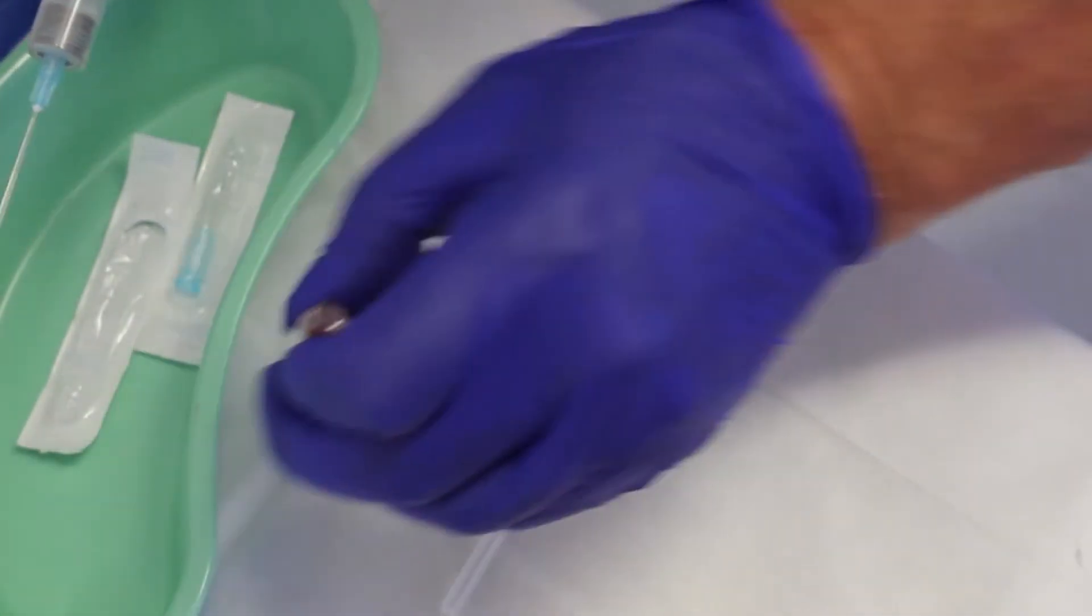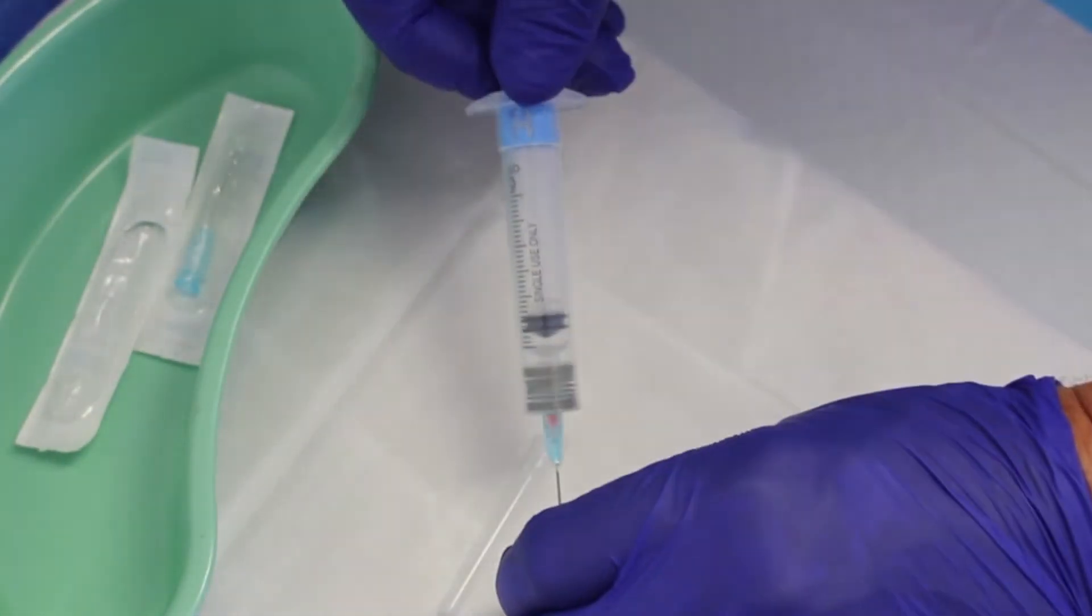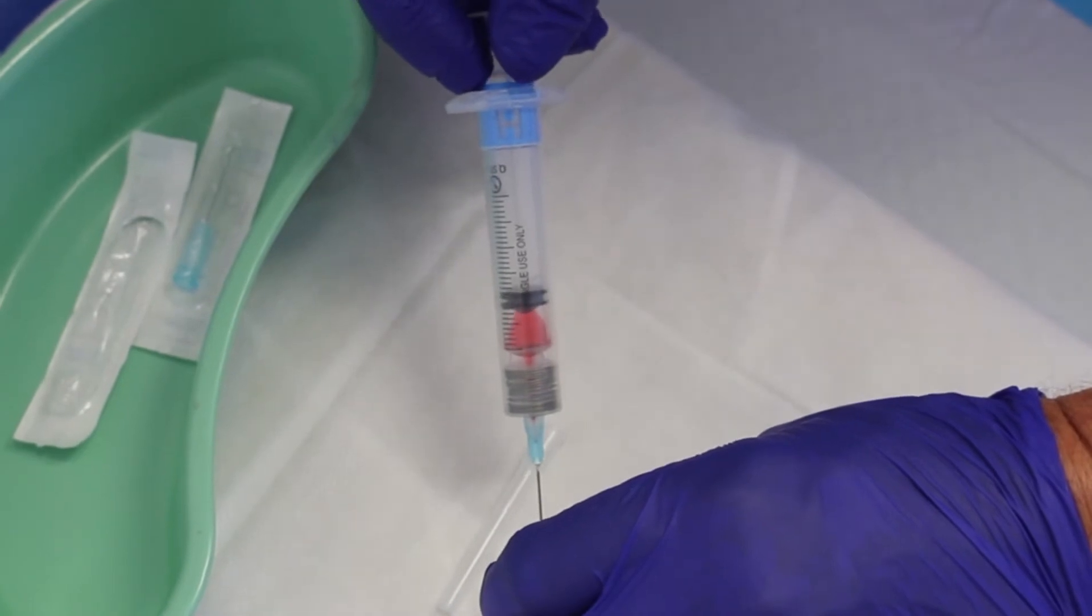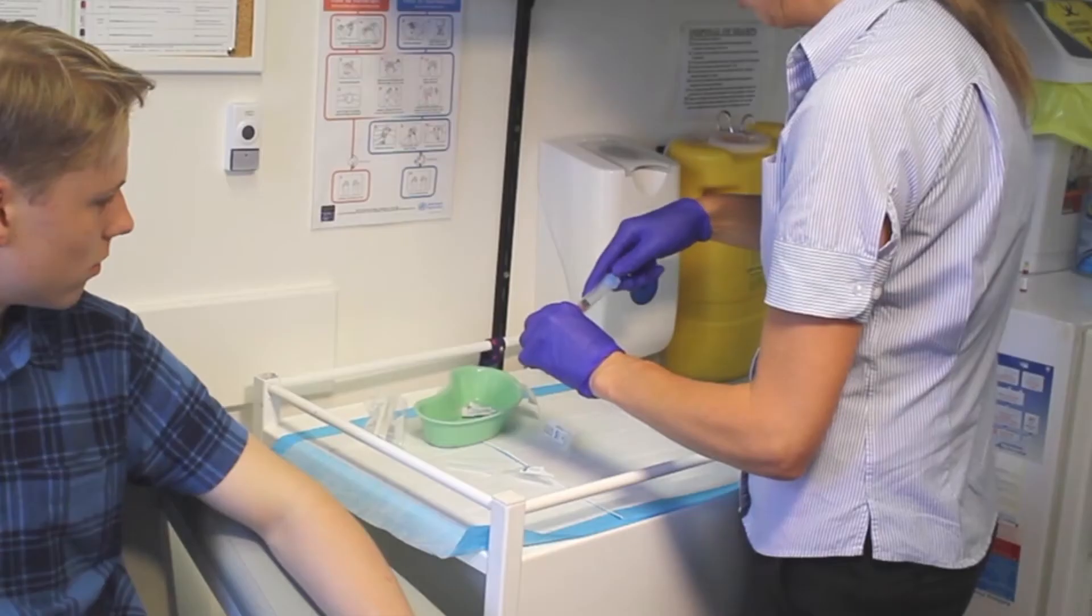To be noted that the syringe uses standard needles, no special needle necessary to aspirate the drug that is to be injected.